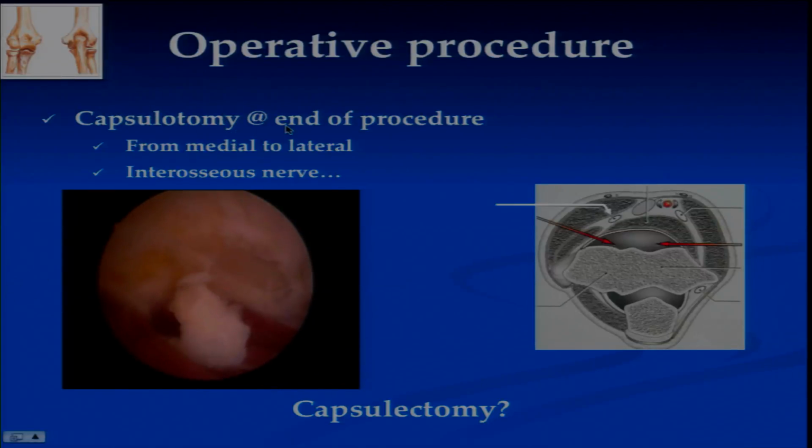And in my experience, and the experience of the French Arthroscopic Society, the only procedure performed arthroscopically was the capsulotomy of the anterior aspect of the joint. The median nerve is protected by the muscle. It has been described once to be resected by a shaver, but it's a real big fault which has been described in arthroscopy, not in our society. It has been reported in the literature.